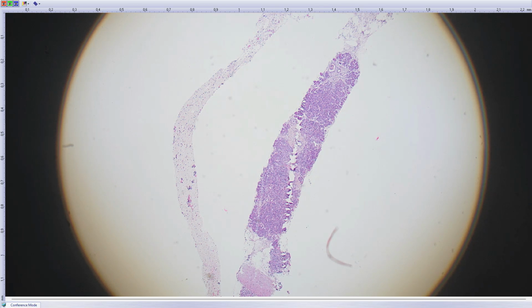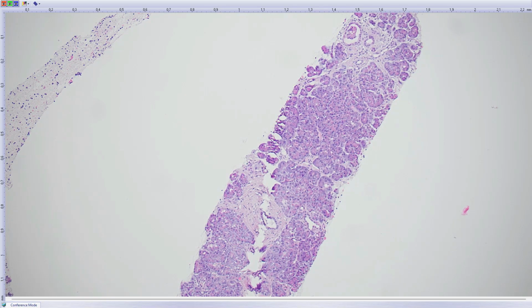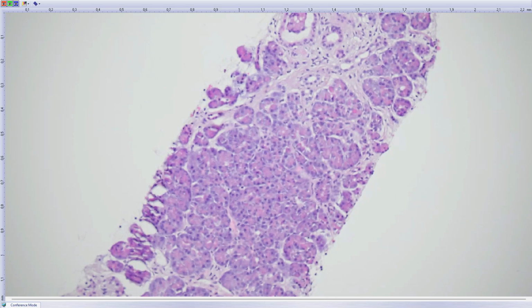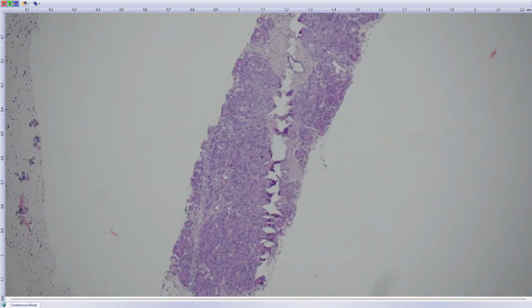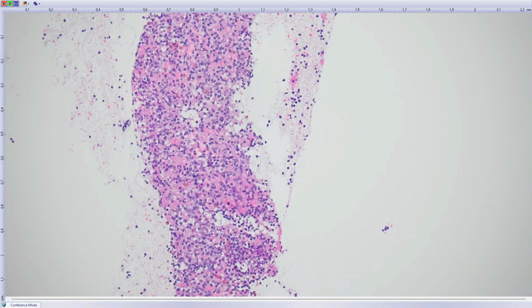My next case is a very classical pancreatic biopsy. I see quite a lot of them, and age is not that important. I saw some lesion. Importantly, it's near the tail of the pancreas. It's almost always there, and you can see these normal pancreatic structures here. And I have already several times showed you the lesion here on the microscope, and the lesion is here. Okay, it's a consult case.